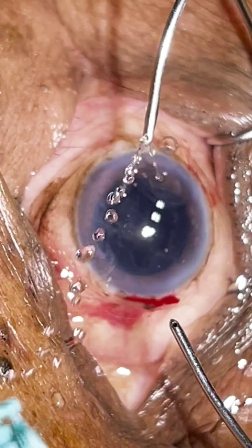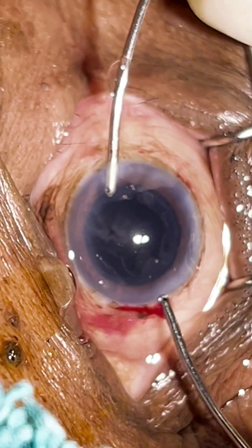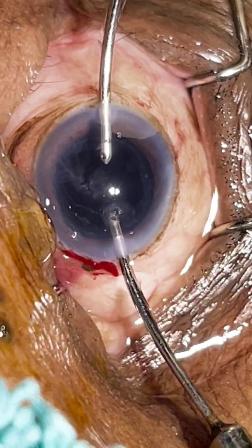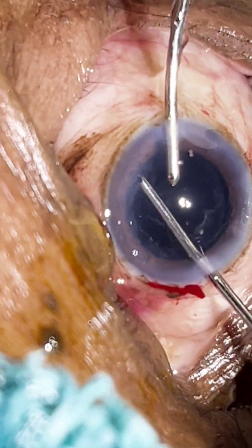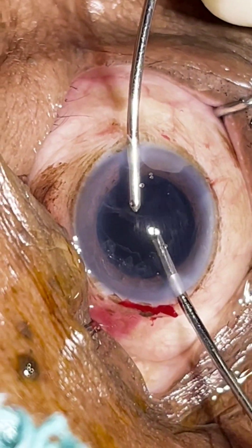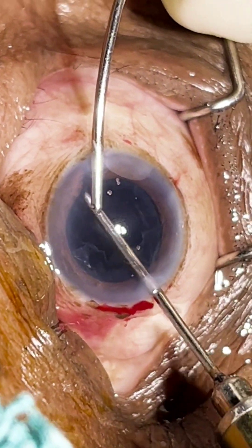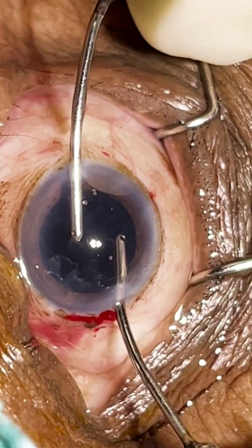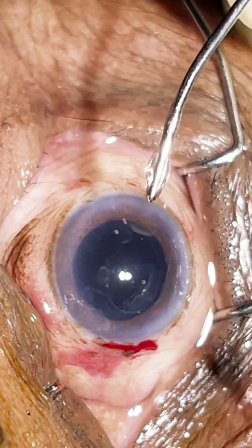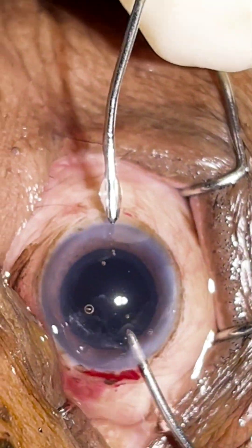Now bimanual irrigation and aspiration. I'm just holding the cortex, bringing it to the center, swiping it from the periphery, bringing it to the center, then aspirating it.